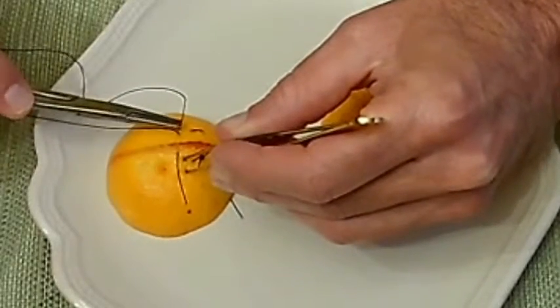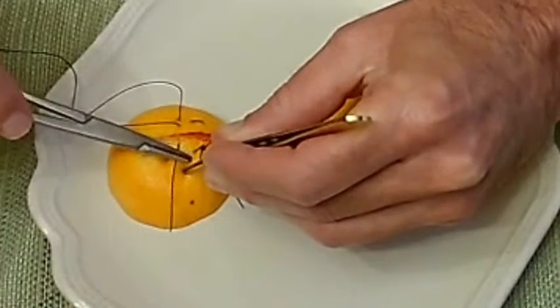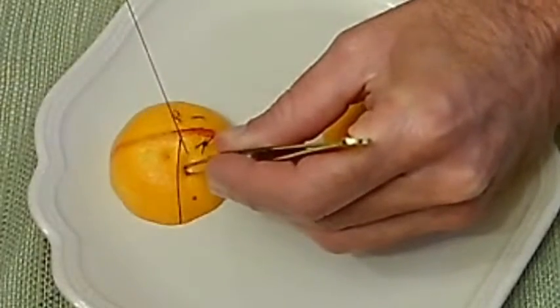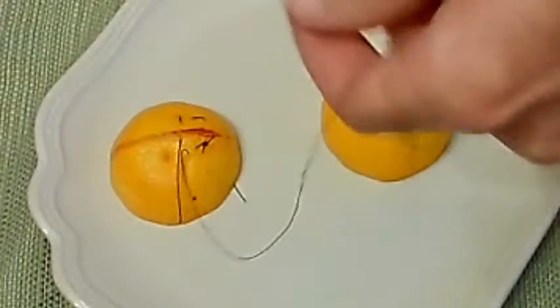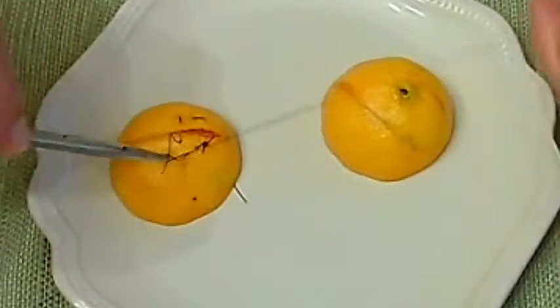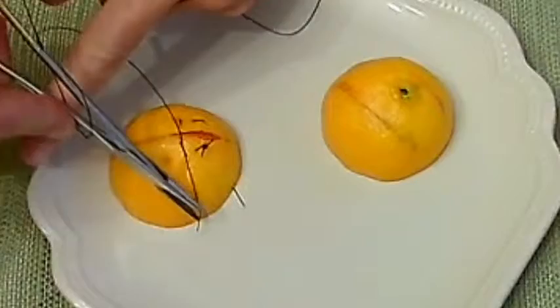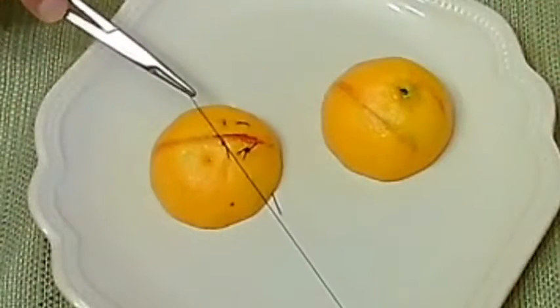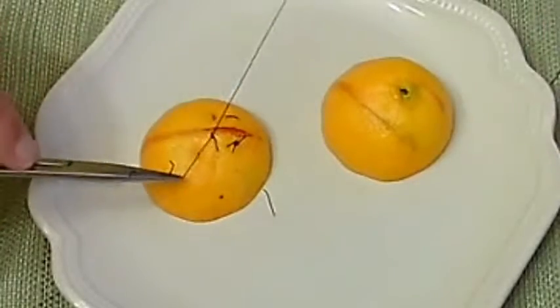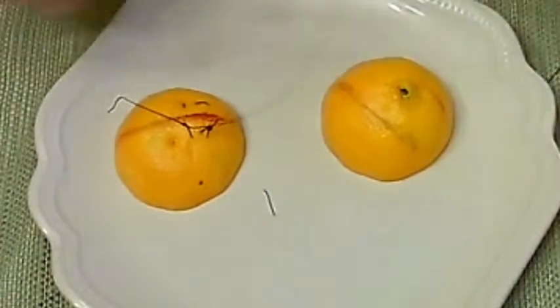If your needle isn't big enough, you do it in two separate passes: you pick up one edge, retrieve it in the wound, and then put it from the wound out the other side — which is often what you have to do if you're not using a big needle. Two passes. You try to lay it down in the direction that you're pulling it. Then the long one gets a lot of skin for grip, and the inside one aligns the skin edges very nicely and prevents them from buckling up on one another.